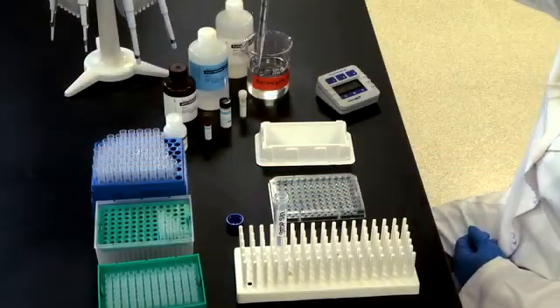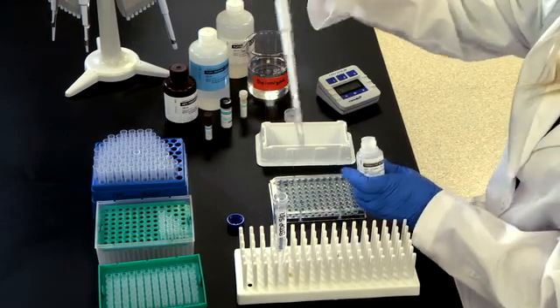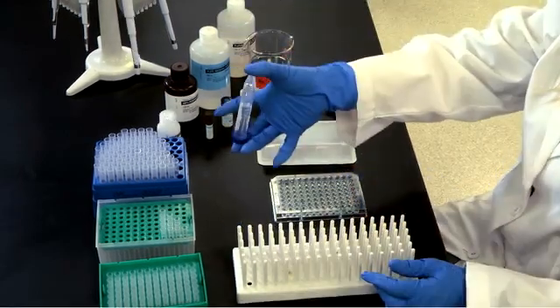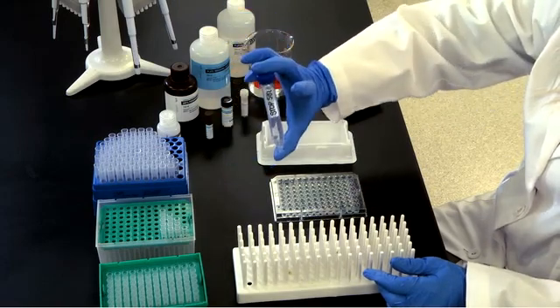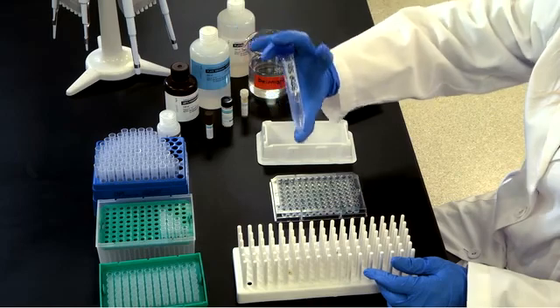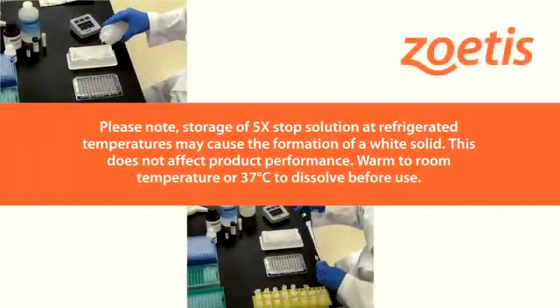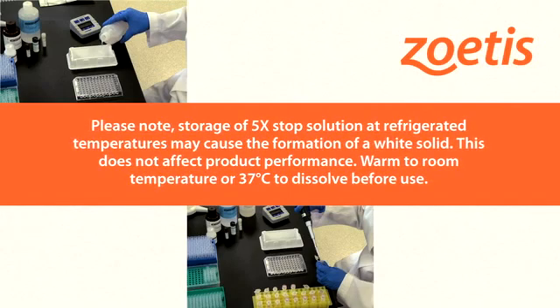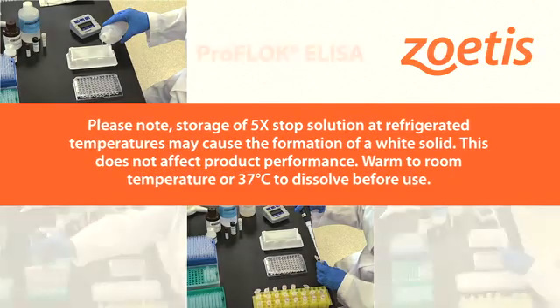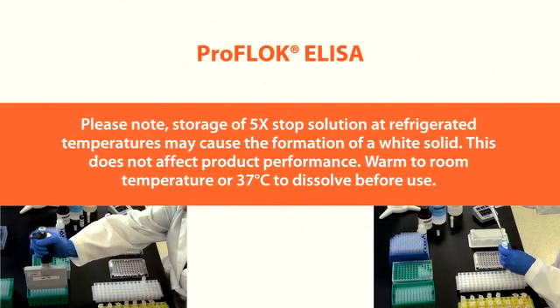Dilute 2.5 milliliters concentrated stop solution in 10 milliliters of laboratory grade distilled or reverse osmosis water for a 1 to 5 dilution. Mix well. Approximately 12.5 milliliters of stop solution is needed for each 96-well ELISA plate. Please note: storage of 5x stop solution at refrigerated temperatures may cause the formation of a white solid; this does not affect product performance. Warm to room temperature or 37 degrees Celsius to dissolve before use.